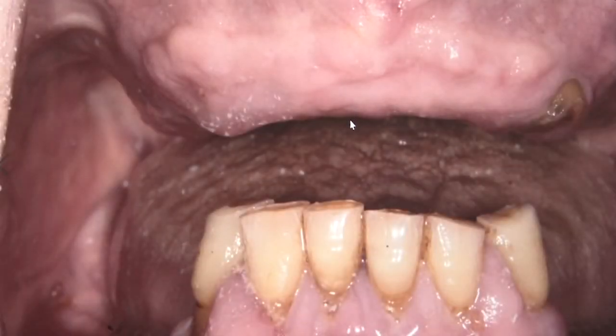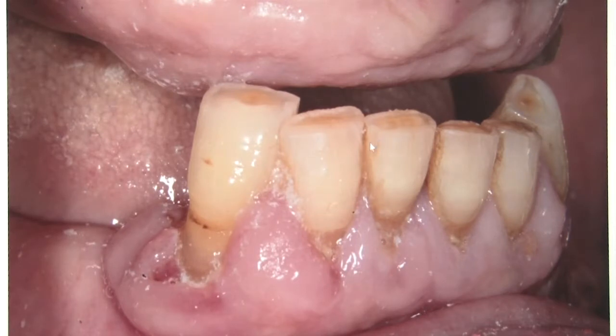Following the removal of all remaining upper teeth and lower left posterior teeth, this is the healing 6 months after tooth extraction. Looking at the right side, you can see that the soft tissues again seem to be going apical, and this will be looked at a little bit more in detail at the surgery appointment. Generalized recession in the mandibular anterior region, and the patient's home care is not nearly as good as it might have been when she was younger.